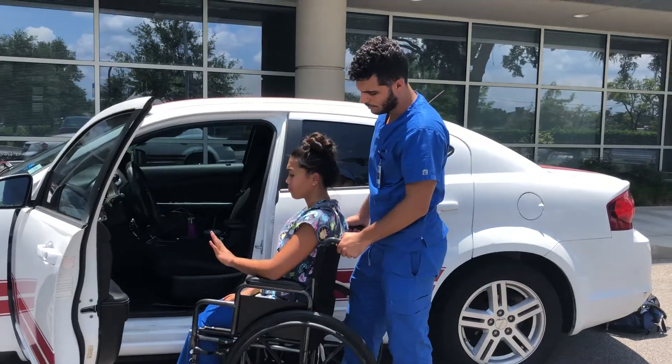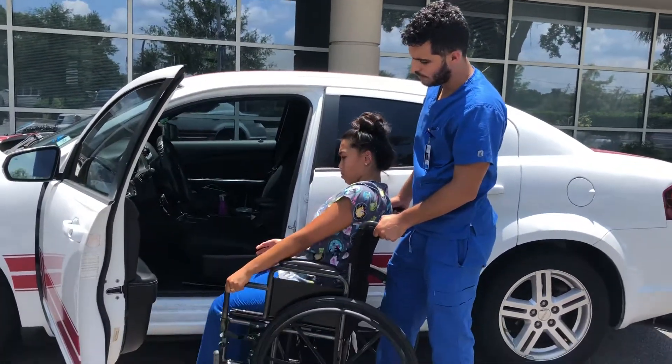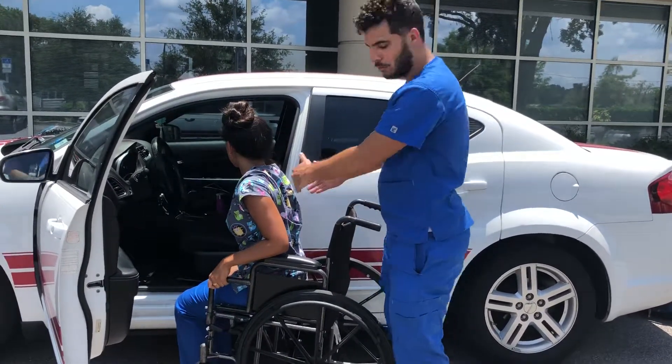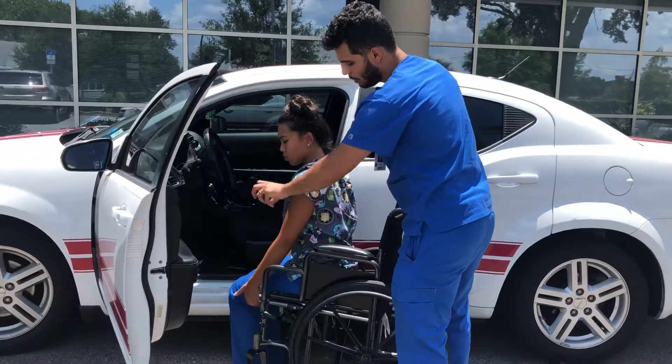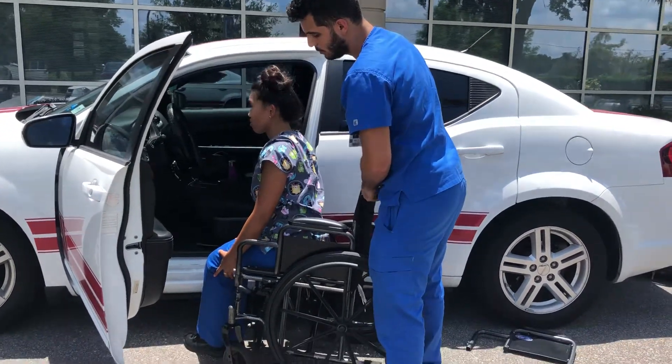With your left hand, Robin, hold onto the armrest and slide your hip forward. The wheelchair is going to be angled into the car. So grab both of your legs and then turn them, angling them facing to the left.